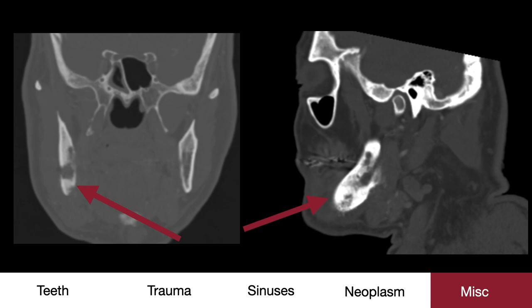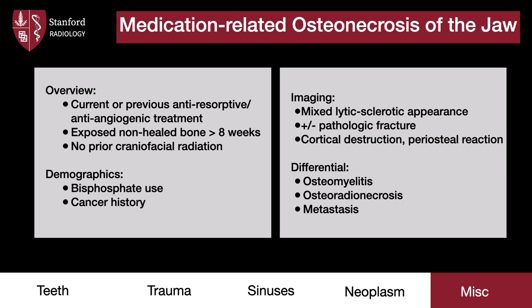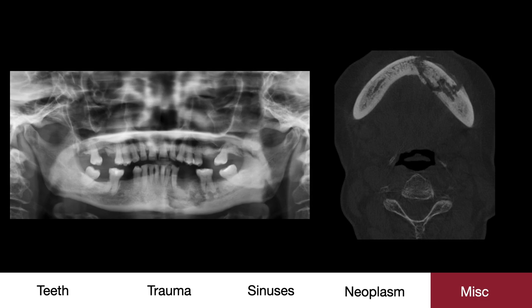The CT further highlights the mixed lytic-sclerotic appearance with cortical destruction characteristic for osteonecrosis. Medication-related osteonecrosis of the jaw requires specific criteria: first, a history of an anti-resorptive or anti-angiogenic medication — bisphosphonate use is the most common; next, exposed non-healed bone for more than eight weeks; and third, no prior craniofacial radiation, which can mimic this entity. It is important to keep this diagnosis in the differential for patients with a history of cancer previously treated with bisphosphonates. The presence of a pathologic fracture needs to be identified. The differential includes infection with osteomyelitis, metastases, or osteoradionecrosis. Note how the entire mandible is sclerotic, and there is a clear pathologic fracture on both the panorex and CT.